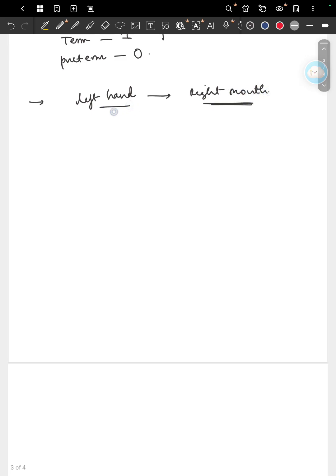This is the combination that we use in intubation. Now pressure has to be low pressure. It has to be forwards and upwards.